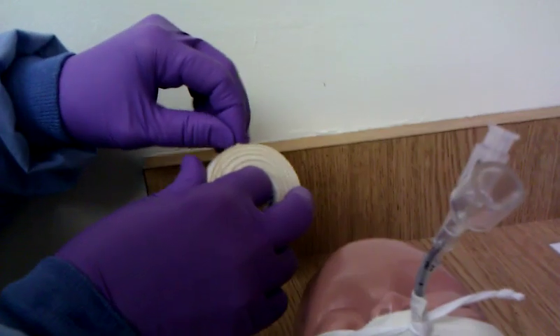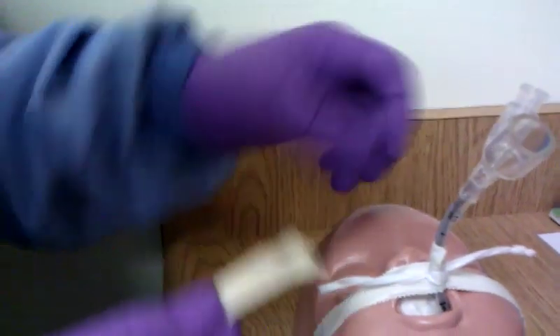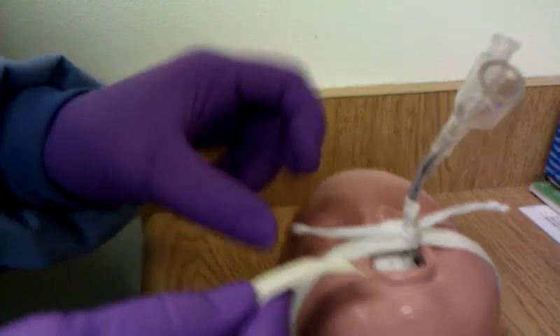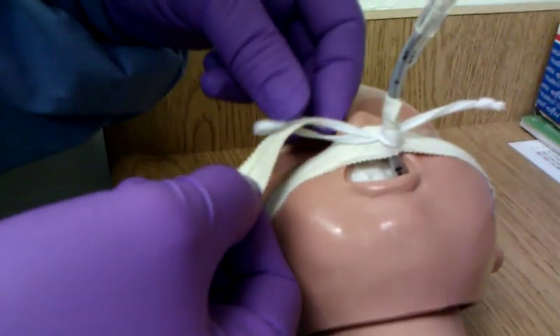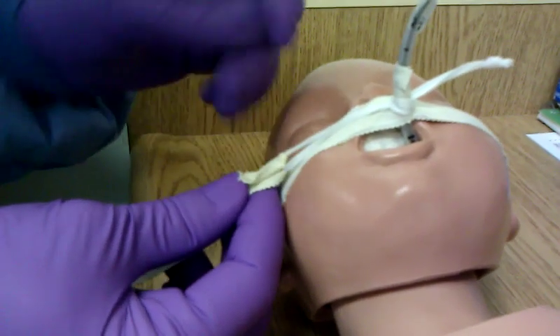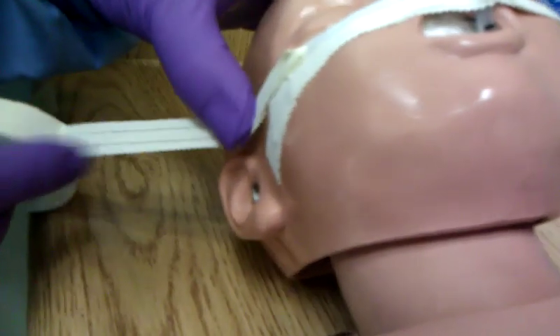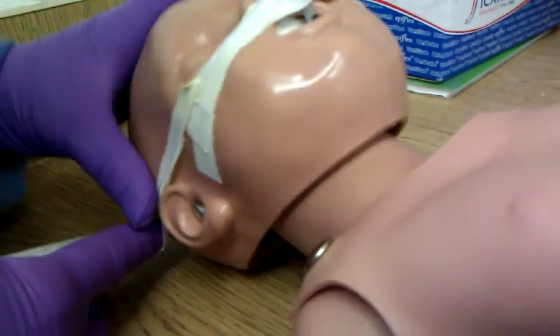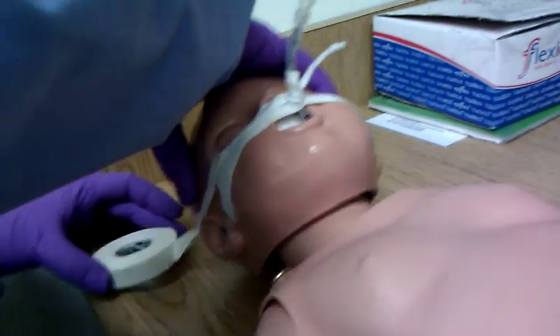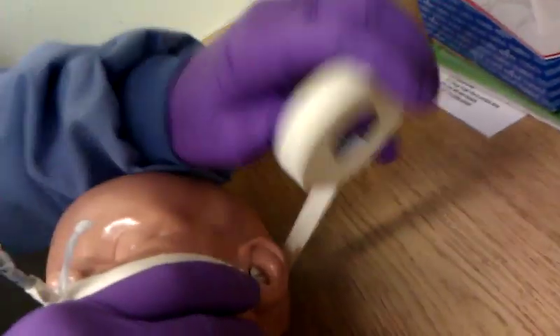And then you're going to take that tape and thread it through one side. Flip it over and go right over the ear, around the baby's head, and then to the other side.